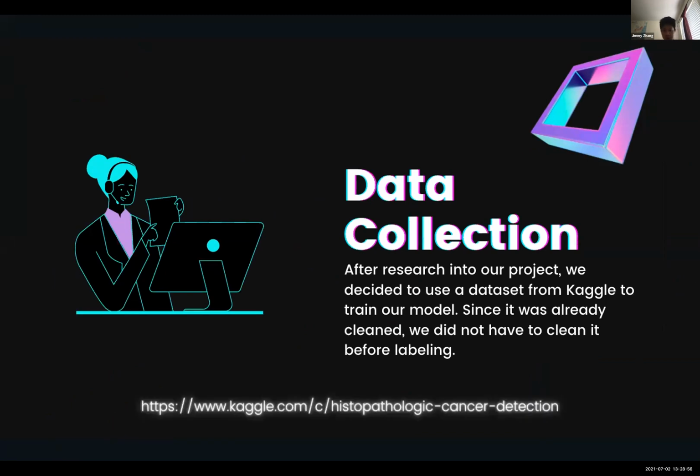Starting off with data collection, we obtained our data from Kaggle's open source histopathologic cancer detection dataset, which initially contained over 250,000 files for training and testing, though we only selected 500 due to time and storage constraints. Our dataset was also cleaned beforehand, so the remaining data processing step left for us was just the labeling of the images.